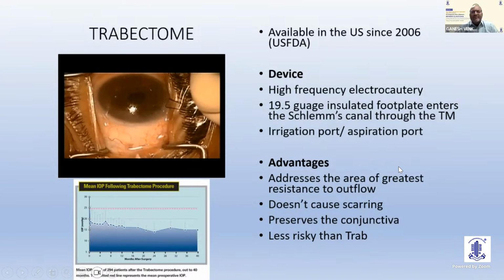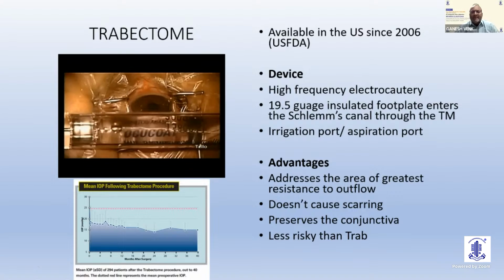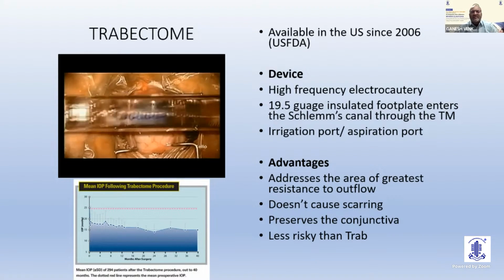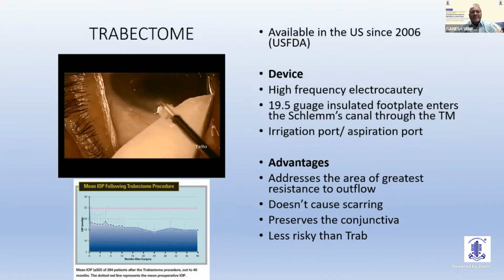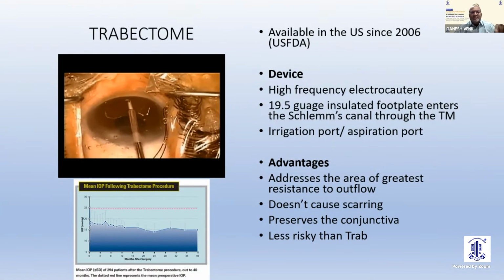It's actually a high frequency electrocautery. It uses a 19.5 gauge insulated footplate, which enters into the Schlemm's canal through the trabecular meshwork. And you have an irrigation port and aspiration port. So what it addresses is the area of greatest resistance, which is the trabecular meshwork.